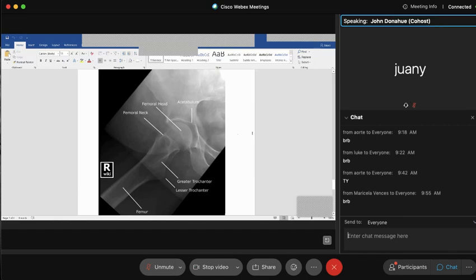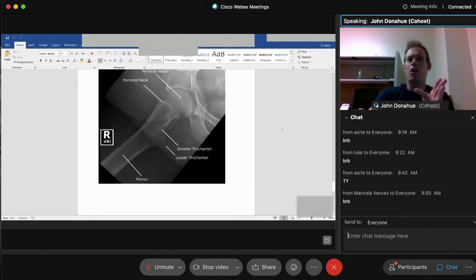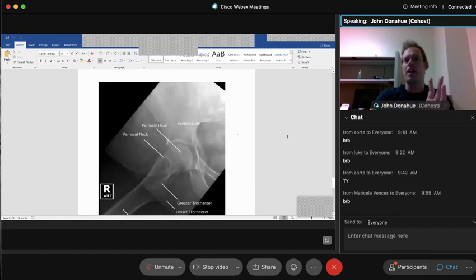I didn't include it. Make sure you know how to identify the bilateral frog leg pelvis as well. You're going to have both those hips in lateral position. So I'm going to try to throw some more images together for you guys, including some of those specialized ones, and send them over to you as soon as I get a chance. Be expecting that in your email to study for the upcoming tests when we get back from the holidays. But start studying hardcore on these images, guys, with this anatomy. Like I said, all this anatomy that's labeled on these x-rays is very important to memorize for me and for your registry.